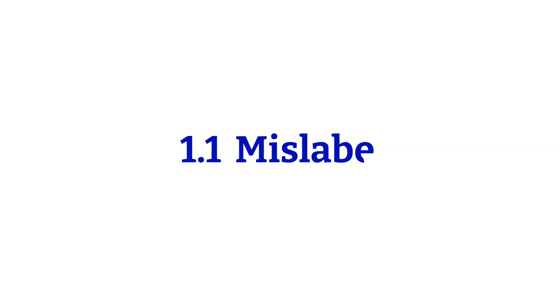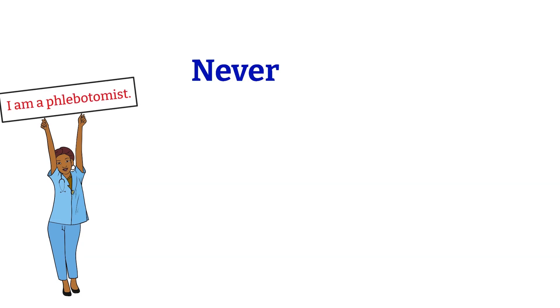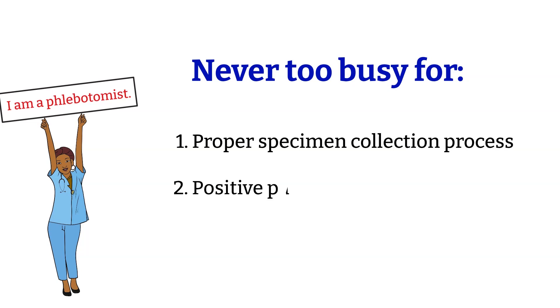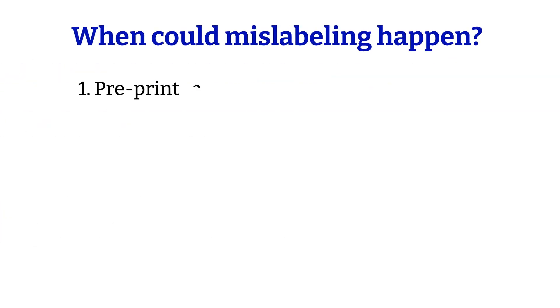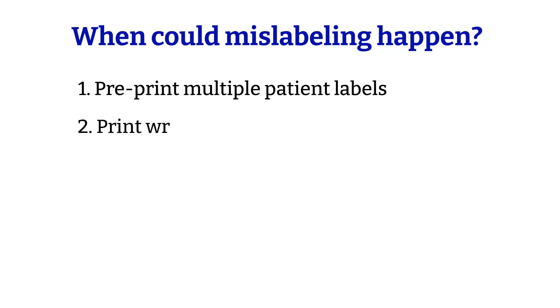These examples show how important our phlebotomists are. It is extremely important to follow the proper specimen collections, positive patient identifications, and labeling process. The processes are there for reasons — I have videos about specimen collections and blood draws, check them out at the end of the video. Mislabeling could happen when the phlebotomist pre-prints patient labels and switches them when labeling the tubes, or prints the wrong label. Once the tube is labeled and sent to the laboratory, it is really hard for CLS to know if the tube was labeled correctly or not.